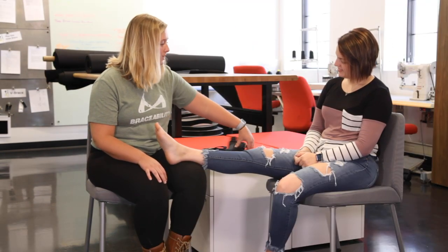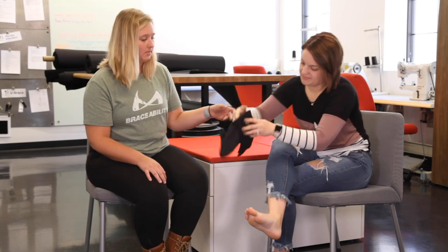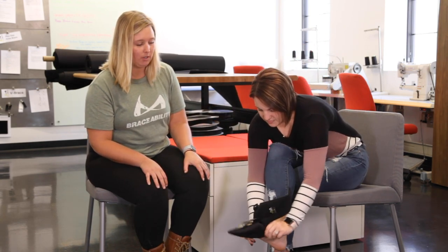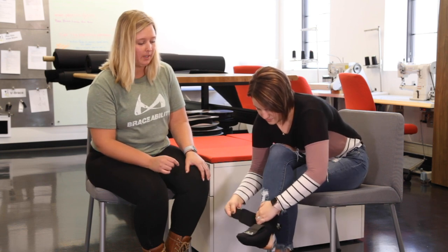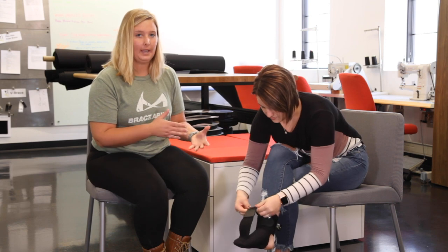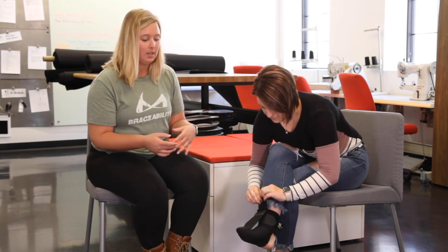After you get the top piece wrapped around your ankle, you're going to feed the strap through the D-ring, and then you'll start feeling those toes being pulled back and the tension in the plantar fascia will be there.